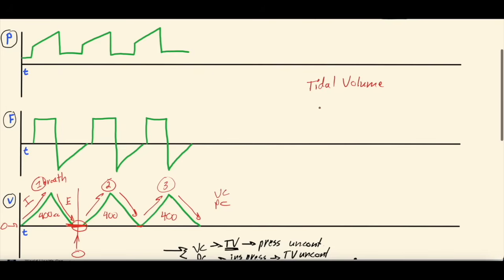If we talk about ventilators, oftentimes there's 3 things we think about with each breath. The trigger, or when the ventilator decides to give a breath. The target, or what the ventilator is targeting, because it needs to target something. It's a ventilator, it's not a human, it can't think. So you have to tell the ventilator, I want you to target X with this breath. And then the cycle, or when the ventilator stops the breath. So the trigger, when the ventilator decides to start a breath, the target, or what it targets during that breath, and then the cycle, when it decides to stop a breath.